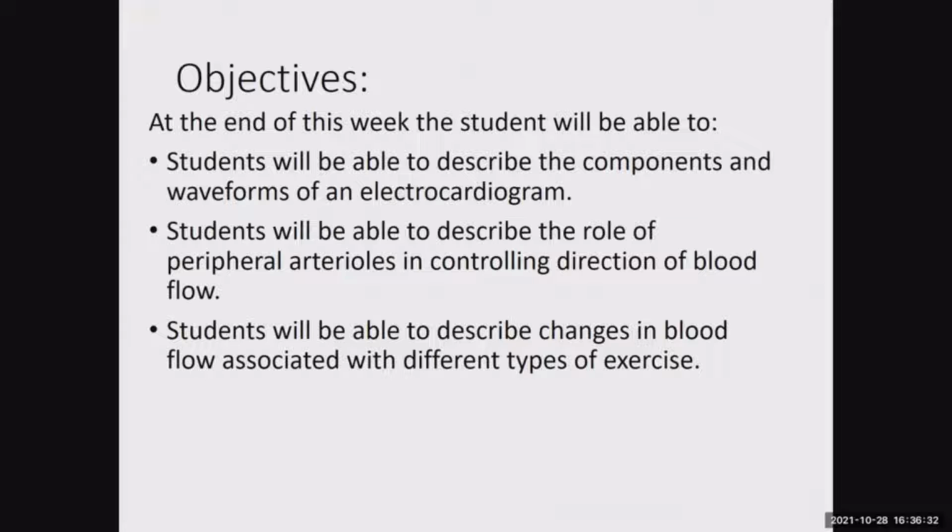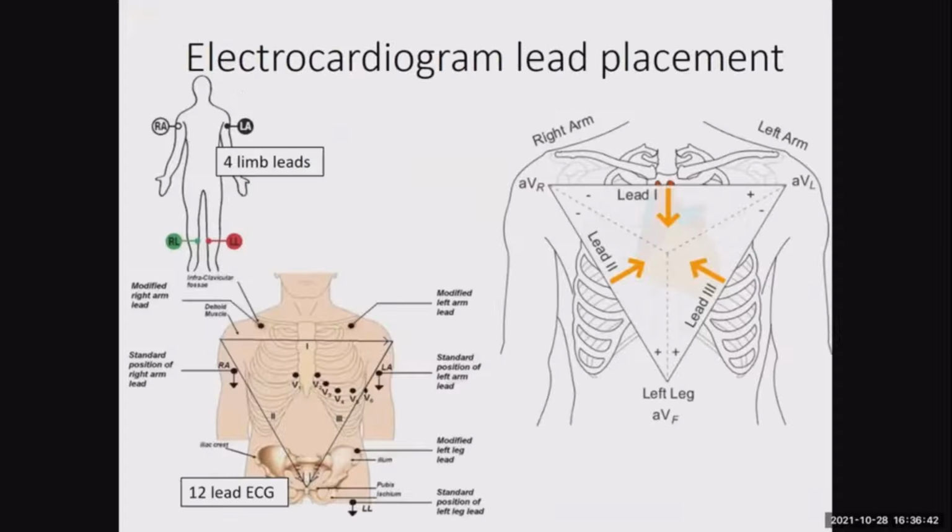As always, here is a set of objectives to help focus on what we feel are important in the activities that we're doing this week. So in this week, we're going to be looking at cardiovascular system functions. And so we'll start out looking at an electrocardiogram, an ECG, previously known as an EKG.